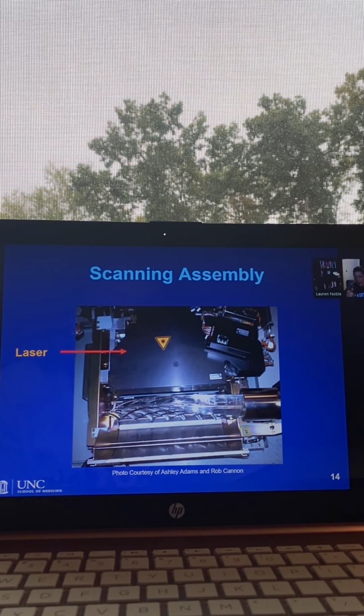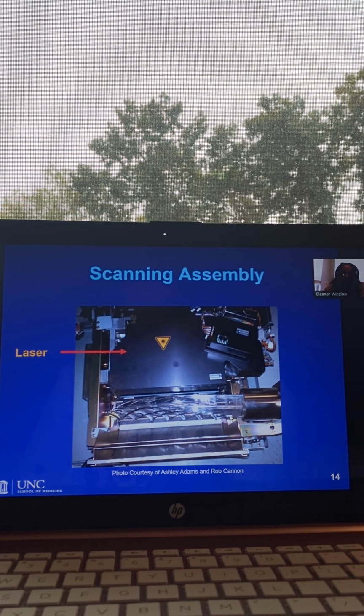And what are they interacting with? I couldn't quite hear. They're interacting with the phosphor crystals, and they're made of what? Barium fluorohalide with a dope of europium. With europium, right. So the barium fluorohalide, those phosphor crystals are ionized, which means they release the electrons.